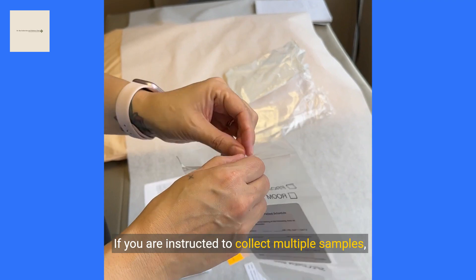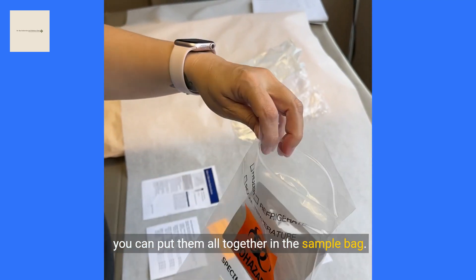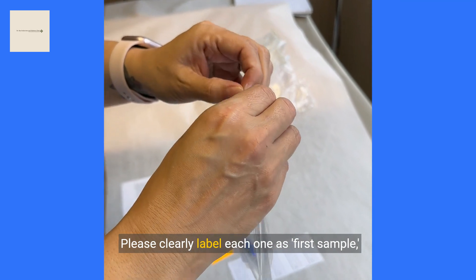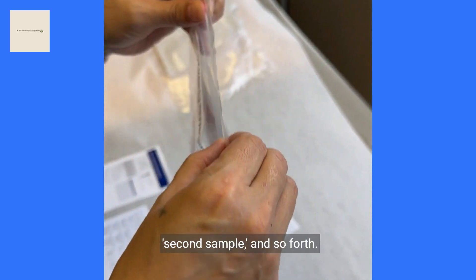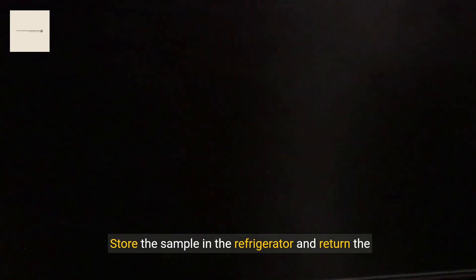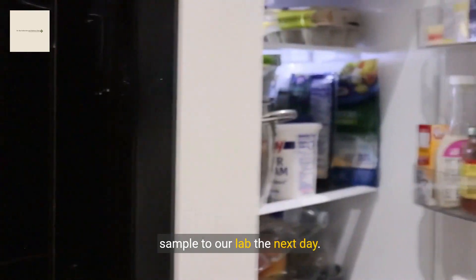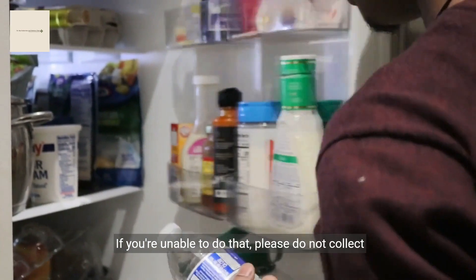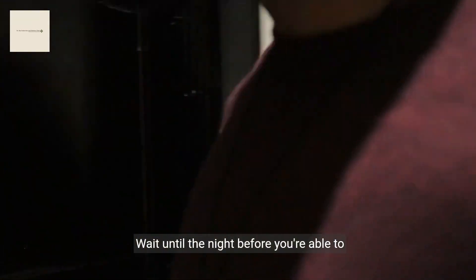If you're instructed to collect multiple samples, you can put them all together in the sample bag. Please clearly label each one as first sample, second sample, and so forth. Store the sample in the refrigerator and return it to our lab the next day. If you're unable to do that, please do not collect the sample. Wait until the night before you're able to transport the sample.